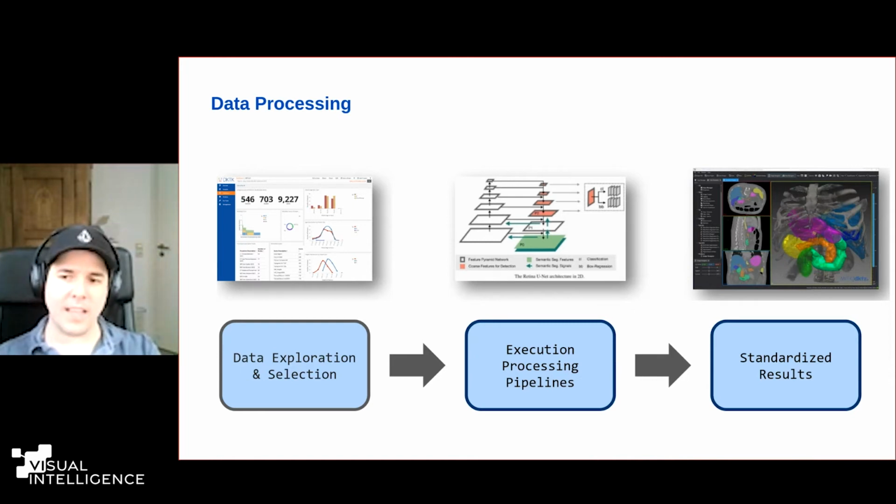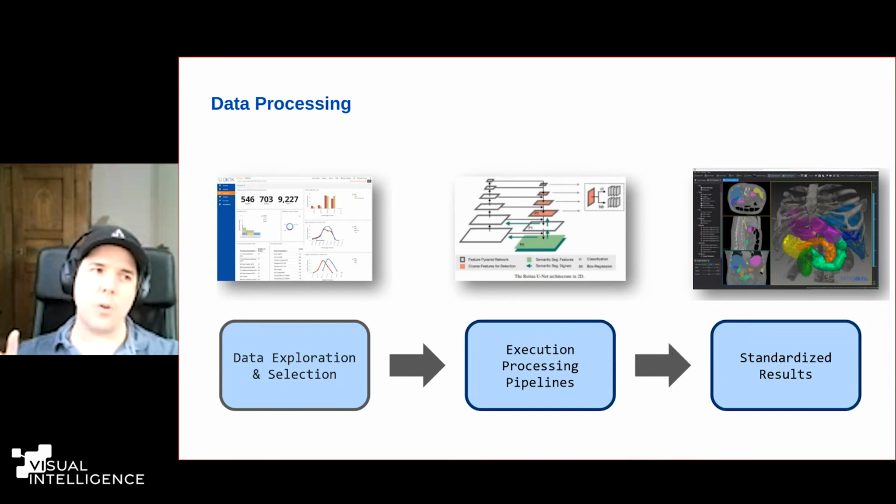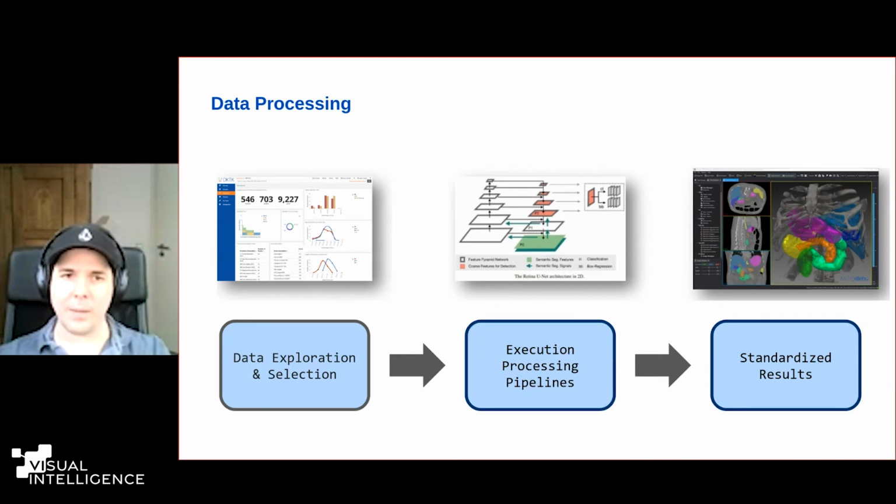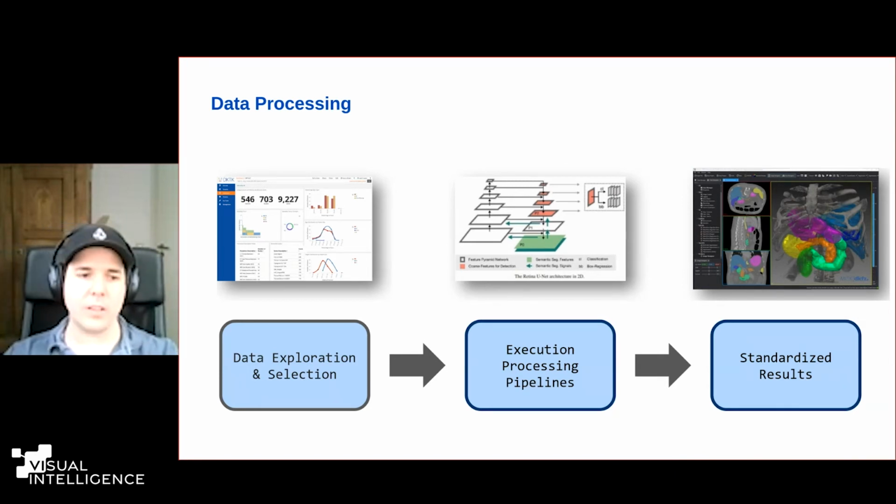And when we are talking about standardization in this context, it almost always means DICOM. So for people who are maybe not aware of that, in medical imaging, there's one big standard, which is called DICOM. It's used across the world. And basically every clinical system understands and speaks DICOM. And so we want to make use of that system to also produce data which is understandable and compatible to the standard. So when we produce, for example, segmentations, we produce DICOM segmentation objects, which can also be understood by the clinical PAC systems, for example, or just by other software.